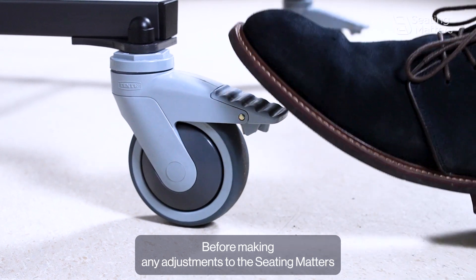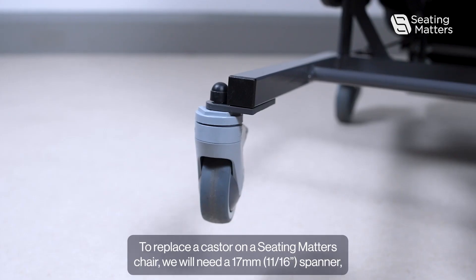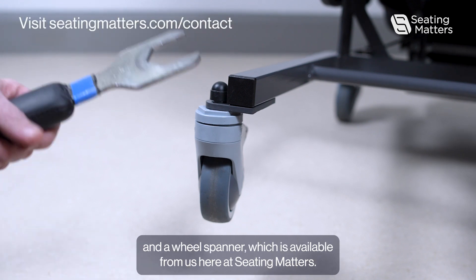Before making any adjustments to the Seating Matters chairs, lock the two brake casters at the back of the chair for safety. To replace the caster on the Seating Matters chair we will need a 17mm spanner and a wheel spanner, which is available from us here at Seating Matters.